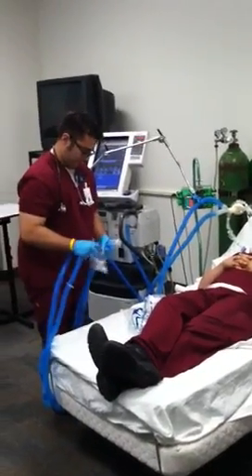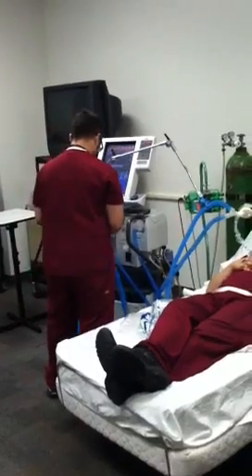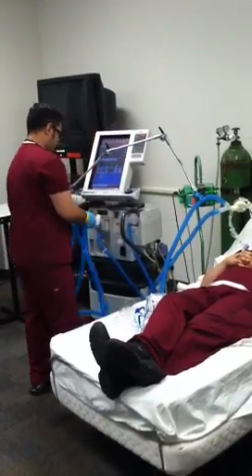We're going to simulate that he replaces the humidifier — he disconnects the used humidifier and replaces it with a new one.